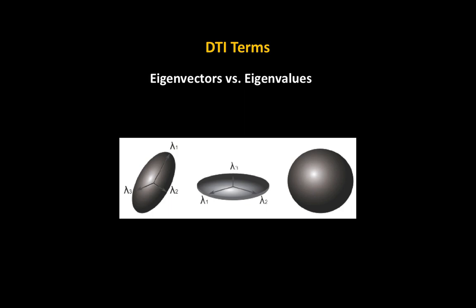One parameter that you also have control over when you're doing a diffusion-weighted imaging scan is the number of directions that you want to sample from. So some people have maybe a few dozen, others can sample 100 or so. Kristen, I don't know what people typically do around here, the number of directions for a scan. I'd say anywhere from 64 to 102, roughly. 64 to 102, that makes sense. Yeah, so what that means is that you are applying those gradients at different directions, right? So you're trying to get as much angular resolution as you can.